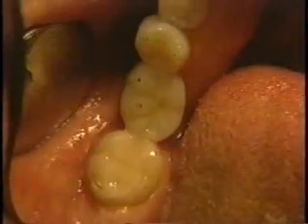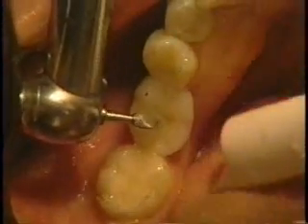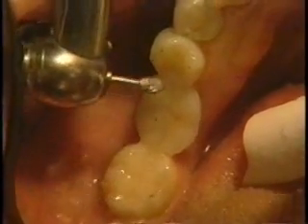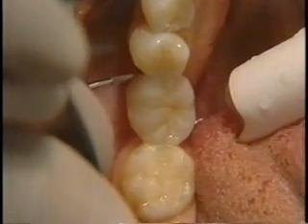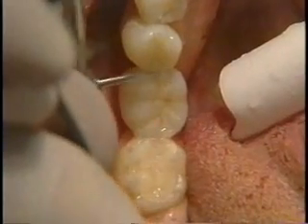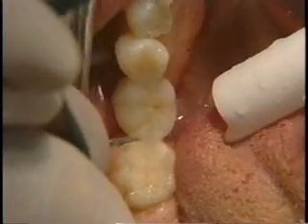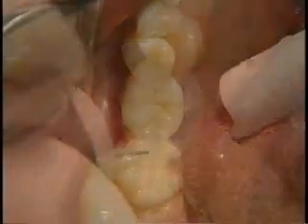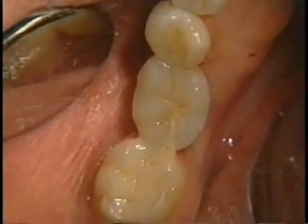Check the occlusion and adjust if necessary. Conventional fluted carbides, interproximal carvers, and polishing agents are used to open embrasures, provide acceptable contours, and impart a final surface luster to the restoration. The glassband bridge offers your patients a highly aesthetic, less expensive alternative to traditional tooth replacement.